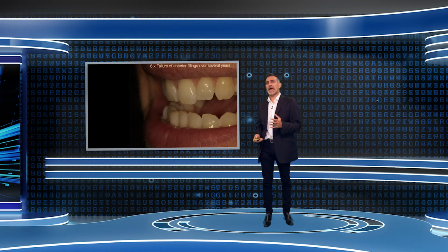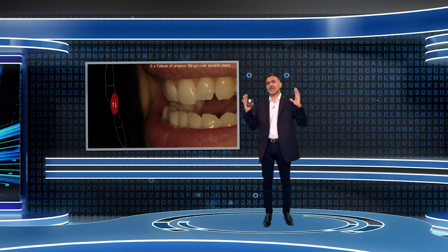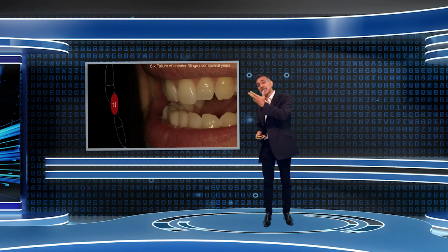And the reason why that's happening is that the upper teeth are continuing to move inwards. They are actually slowly retroclining. The lower crowding is causing the canines to collapse and that front tooth to spill forward. And as a result, instead of having a clear envelope of function, the patient ends up with a constricted envelope of function. So the teeth will chip, they'll slice slightly and they'll chip and they'll move and they'll basically keep moving and keep slicing off whatever restorations are there.